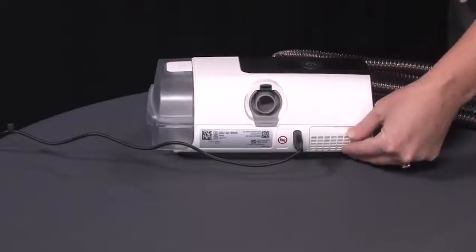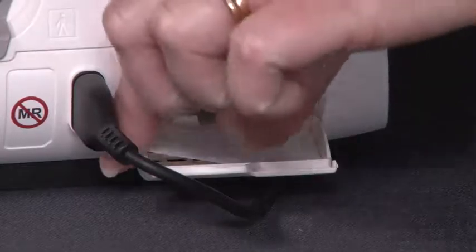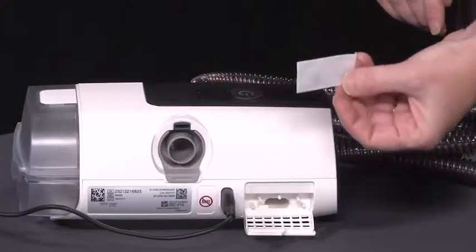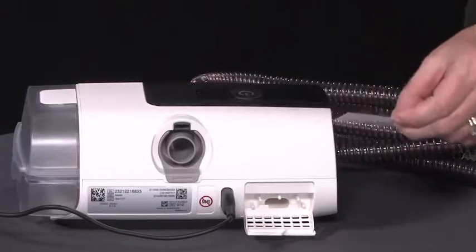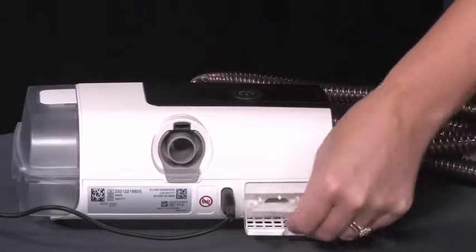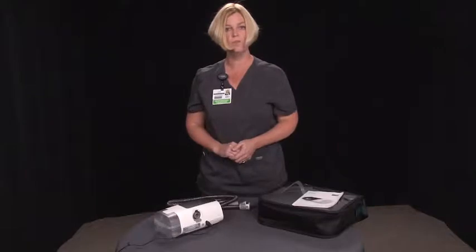You want to change this air filter about every 4 weeks. To change it, you will open this tab. Inside is one thin filter. This filter is disposable and you can flip it on either side. It does not matter. You would get a new filter in a package like this in your bag. You would take the new filter out and insert it in that flat spot. Then close it up and you're ready to go.